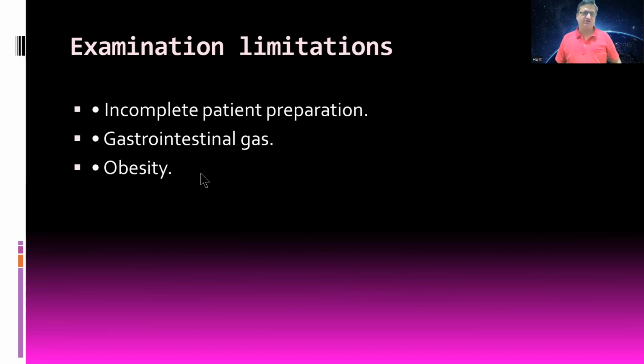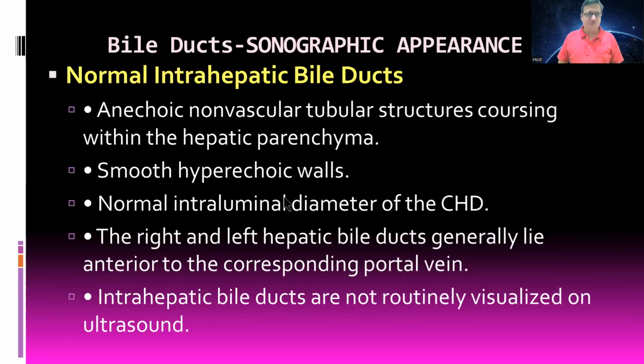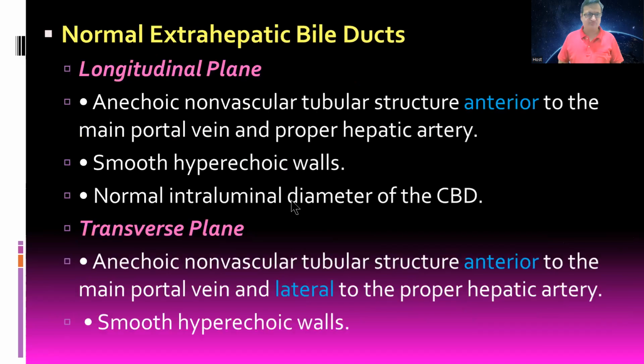In imaging, these are the limitations: incomplete patient preparation, gastrointestinal gas, and obesity are the limitations. Sonographic appearance we already discussed.